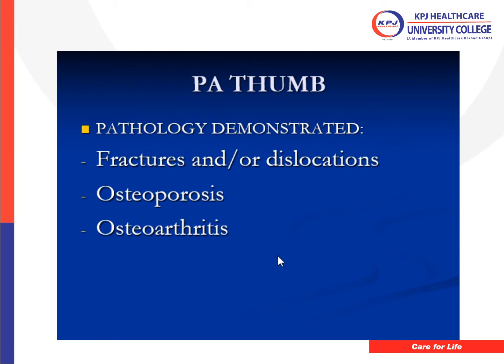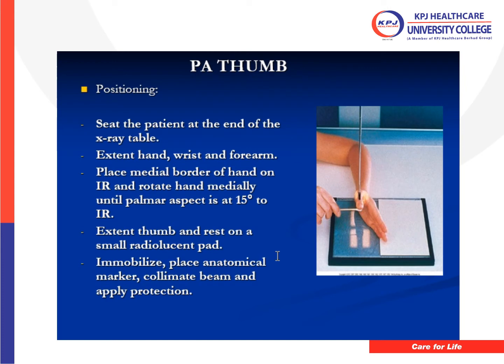Pathology, fractures, is the same as before. So this is the positioning.